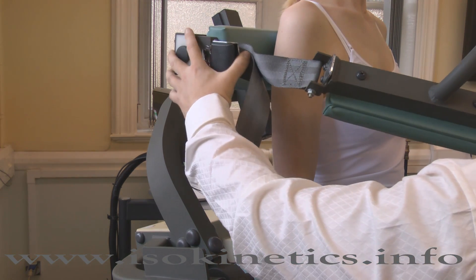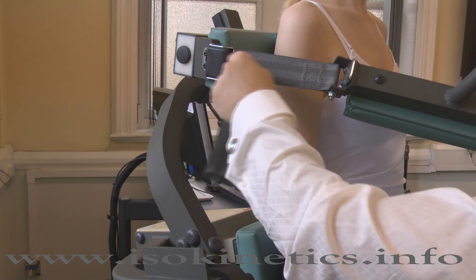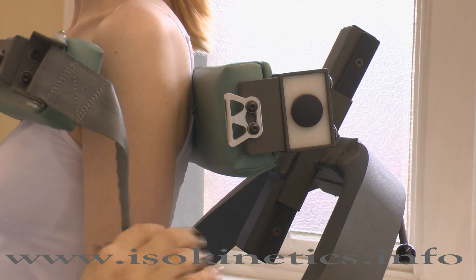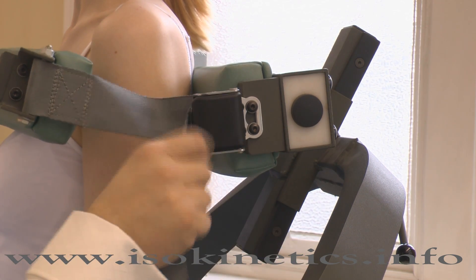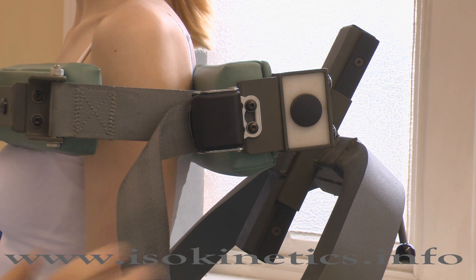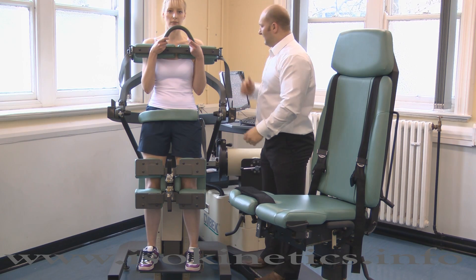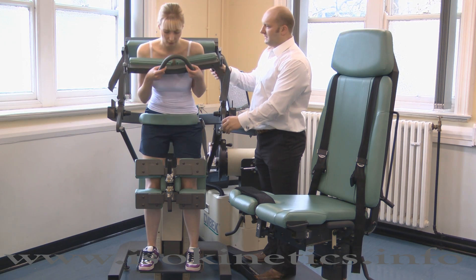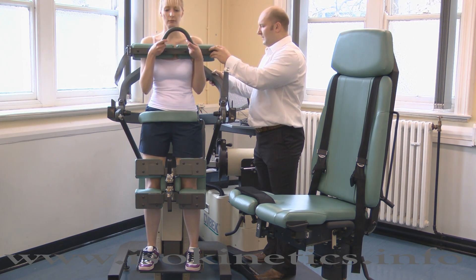Finally, secure the chest pad. Start by attaching one side using the snap lock clip, then repeat for the opposite side. Adjust to comfortable tension by altering the straps. Note well: in some circumstances it may be necessary to have the handle pointing upwards, as this allows a larger range of motion. However, the handle would normally point downwards. Positioning is now complete.